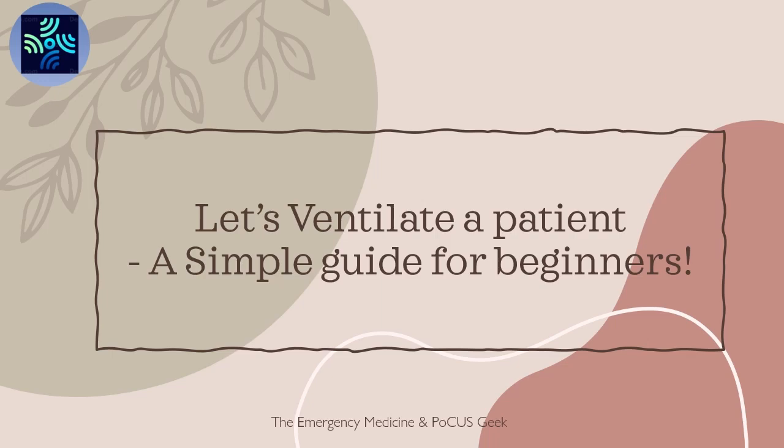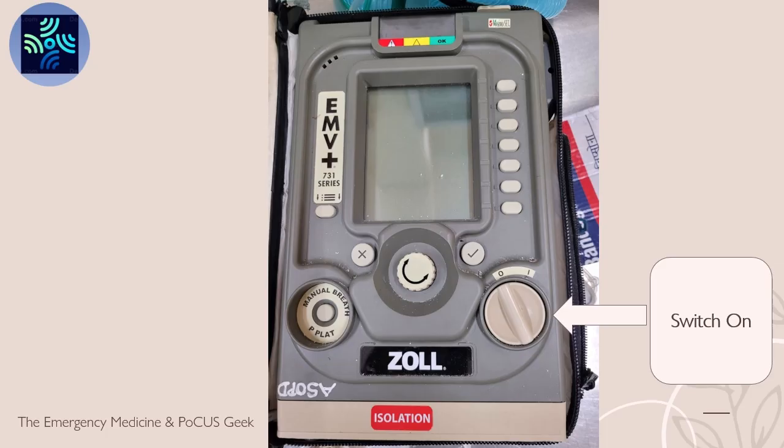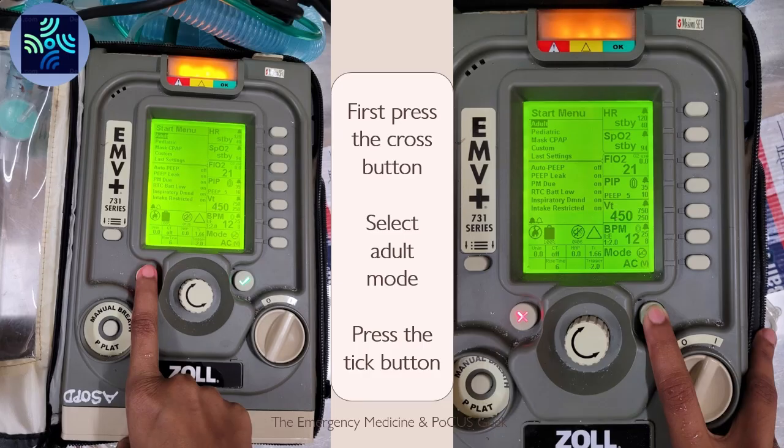Let's ventilate a patient. A simple guide for beginners. I will demonstrate how to use the Zoll portable ventilator. Switch on the machine by turning the dial in a clockwise direction. First, press the button with a cross. Select the adult mode using the dial and press the tick button.